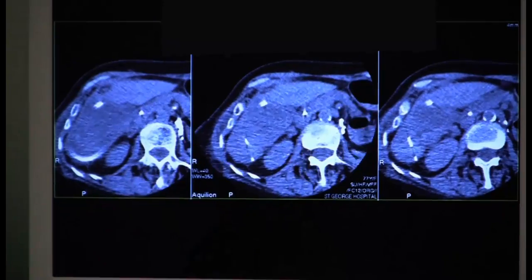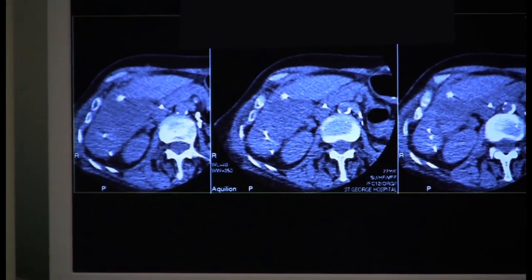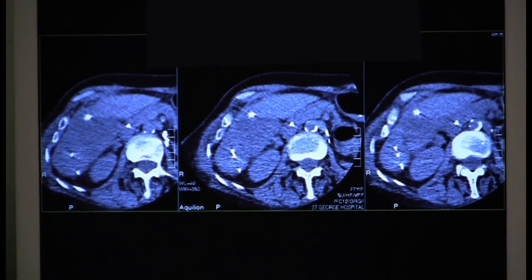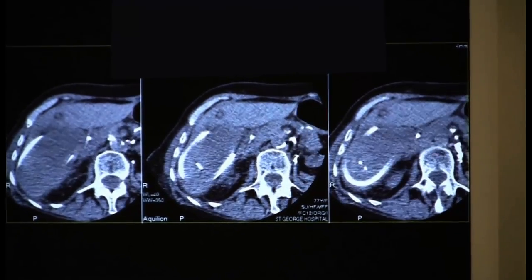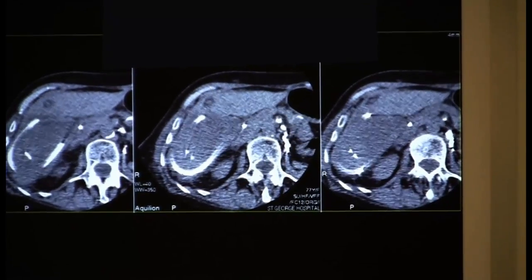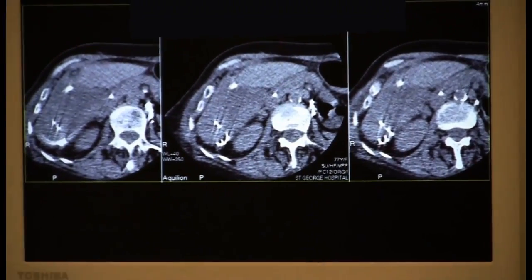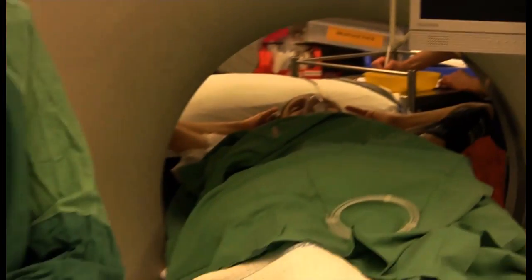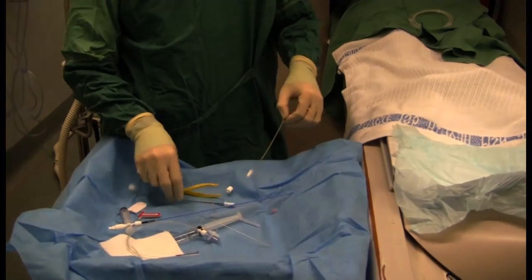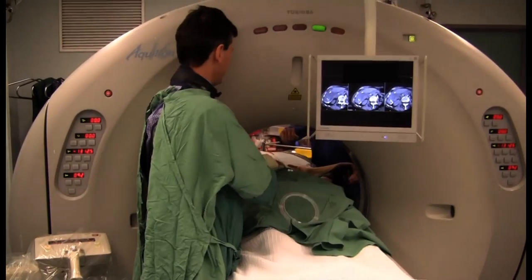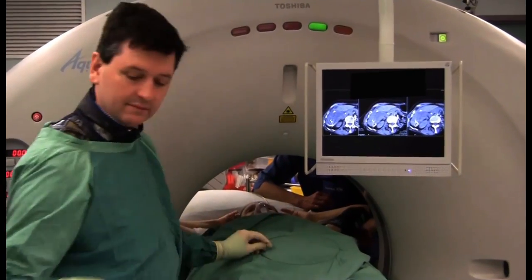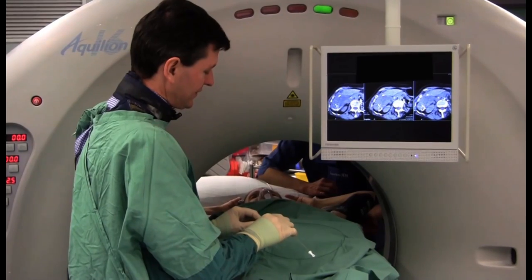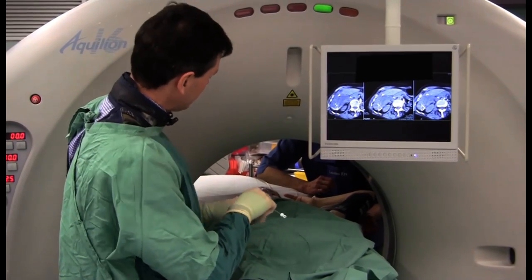You can see the guide wire looping around inside the collection. The guide wire is not free-floating, so maybe this collection is somewhat gelatinous. We may not get as much out of this drain as we might like, which would explain why the surgical drain is not working either. Sometimes collections are a little gelatinous and you can't actually tell until you try to drain them percutaneously. We've given the balance of the fentanyl — we now have 100 micrograms fentanyl and 2.5 milligrams midazolam on board.